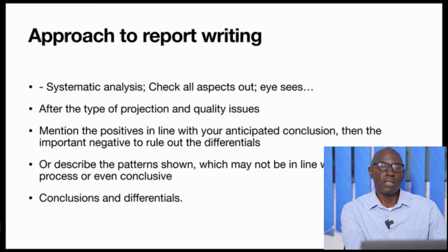Now, the approach to report writing can be very interesting, and it can vary from department to department, hospital to hospital, and it also varies between radiologists. But there are some aspects of the report which are always constant. As one is approaching a radiograph to make a report, first and foremost, you must ask yourself, what was the presenting symptom? Is it cough? Is it fever? And these may be a guideline.